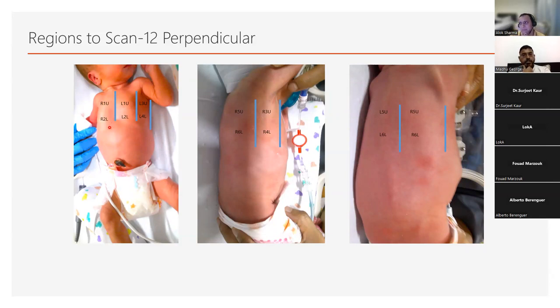So in 6-region techniques, what I knew till now, is that those 3 regions on either side are anterior upper, anterior lower, and a lateral. Yeah, that's Brat's score. That's Brat's scoring. You're using Brat's method. So you're right. It's right anterior upper, right anterior lower, and lateral.